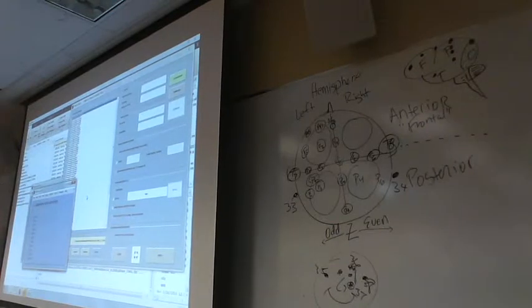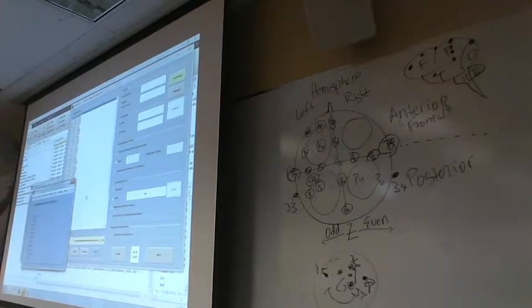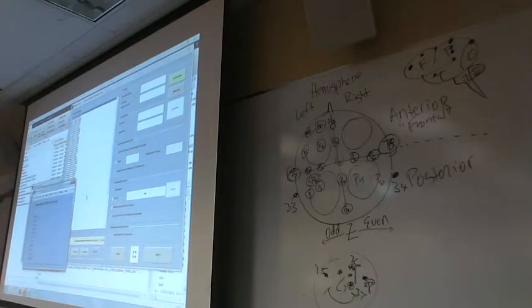Can everybody read what I'm writing here? Okay. Label, let's say it's AN for animacy. And then for our item judgment, we're just going to put the number 1, so we know that they made a 1. And then our third digit, that's why it was important. We tested it this morning on the quiz and we talked about it in the introduction. Our third digit for source memory, for a 1, means they got the source correct, but with high confidence, right?